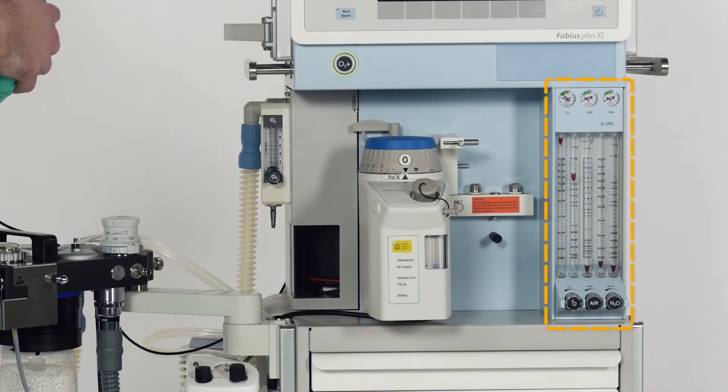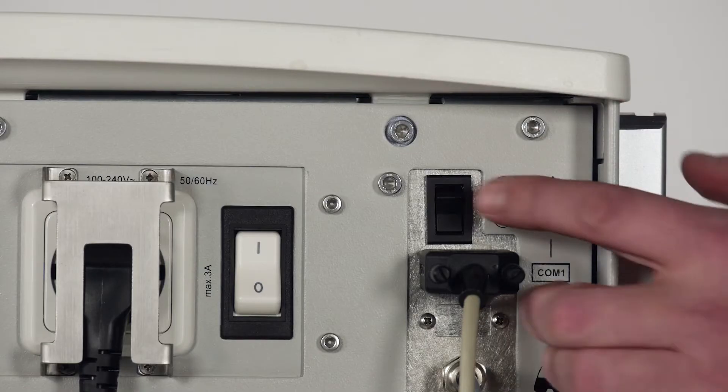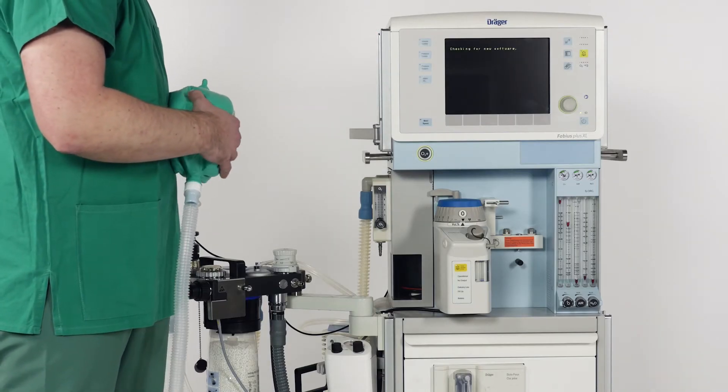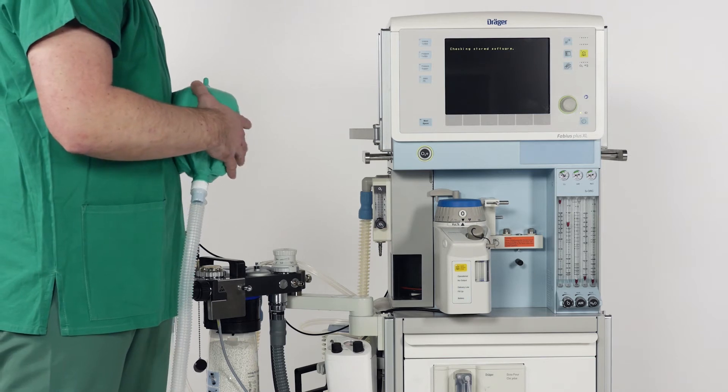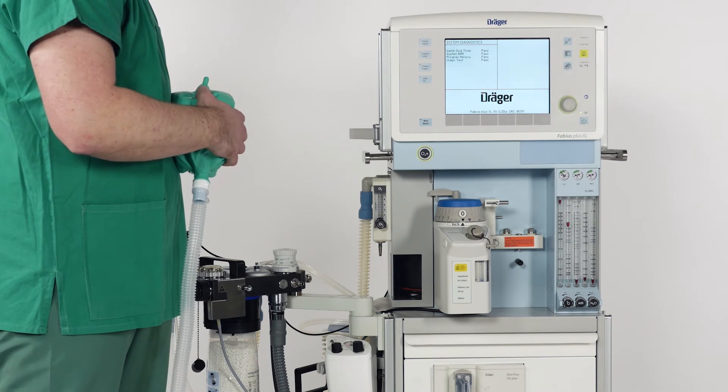If needed you can add air, nitrous oxide and anaesthetic agents to the fresh gas mix. You can now switch the device on. It will perform a brief system test and will go to standby. During the entire time you can continue to manually ventilate.